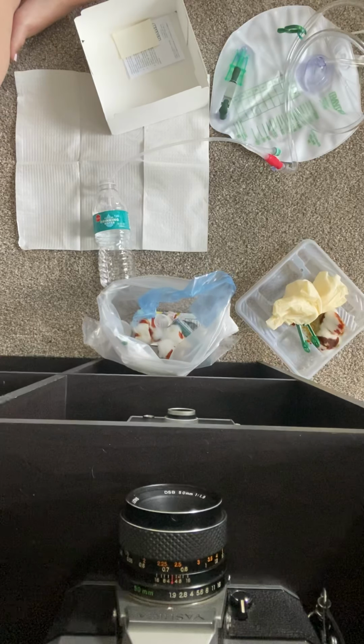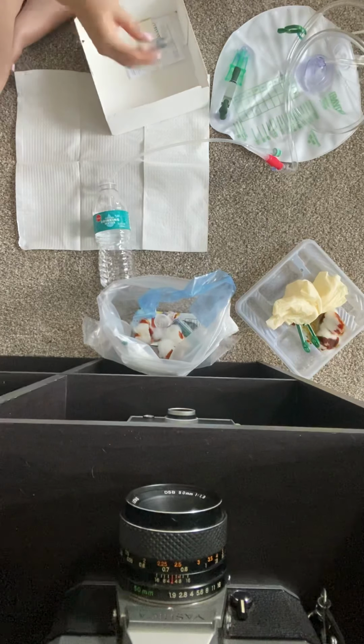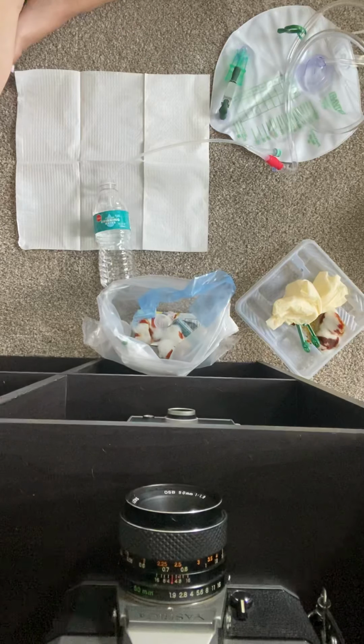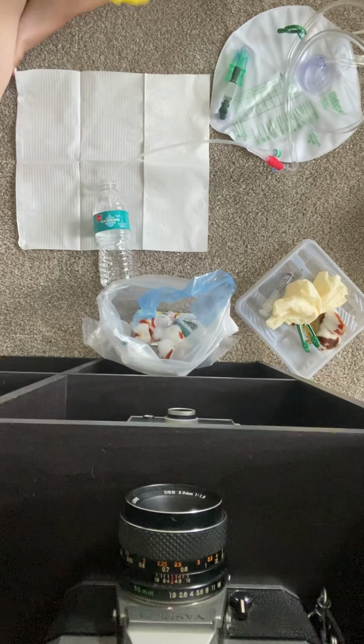So what I'm gonna do is go ahead and remove my Foley now. For this I would just need some regular gloves. I'm actually gonna keep this syringe, but I am gonna move this out of the way. So let's say I have a syringe here. Let me put my gloves on. I would do my hand hygiene, obviously, before taking this out.